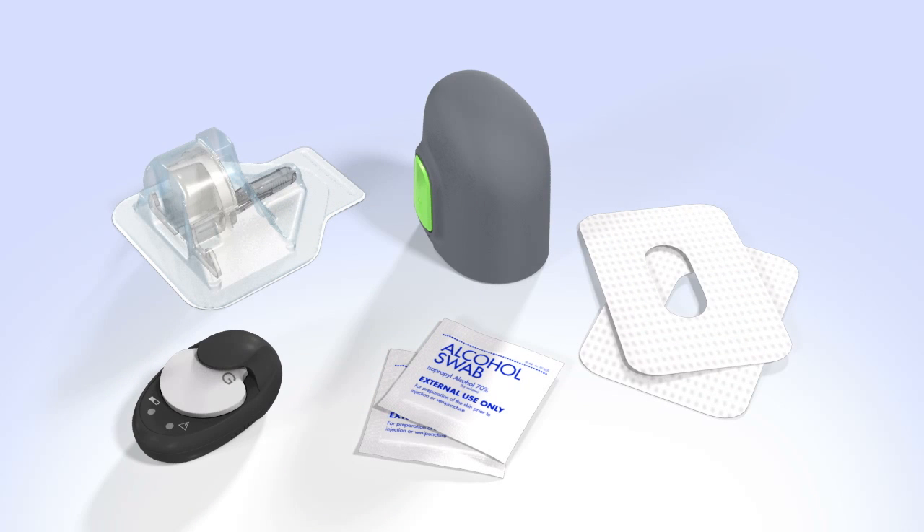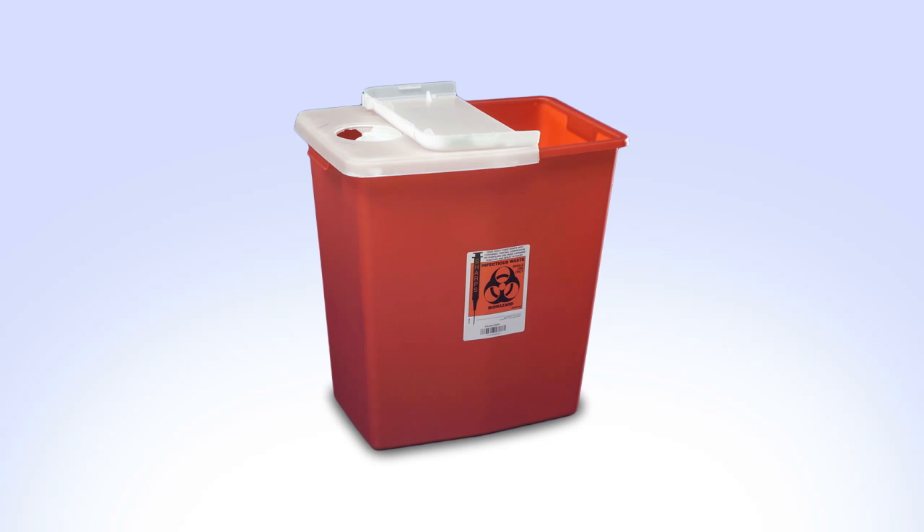When you are ready to insert your sensor, gather the following supplies: an N-Lite glucose sensor, the one-press serter, sensor overtape, a Guardian 2 Link transmitter that has been fully charged, an alcohol wipe, and a sharps container.